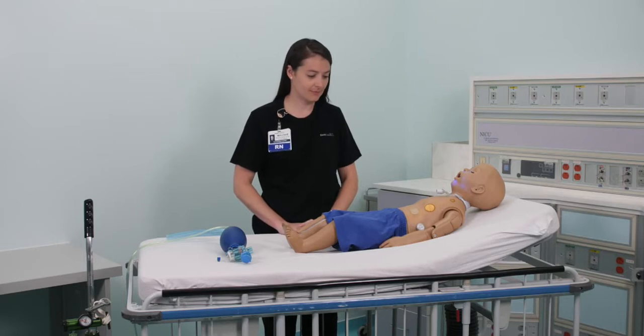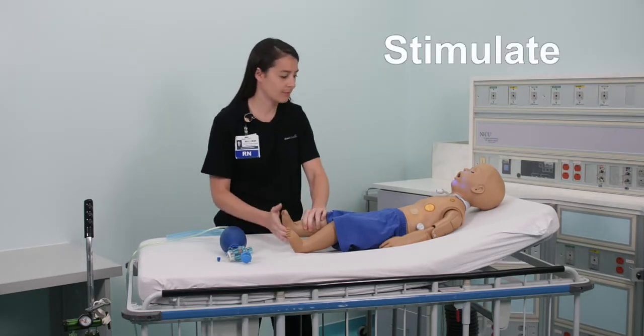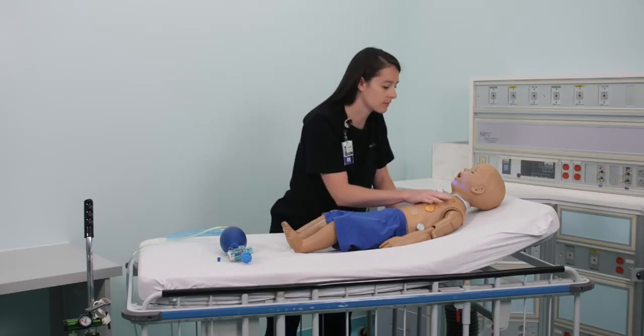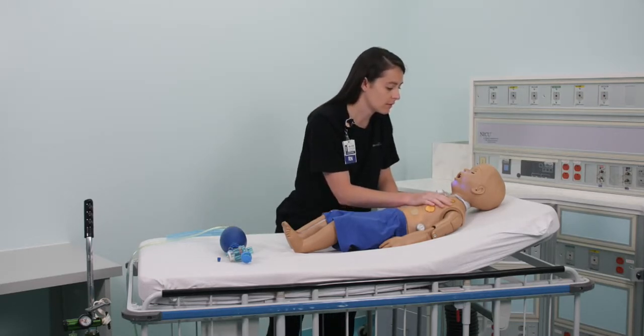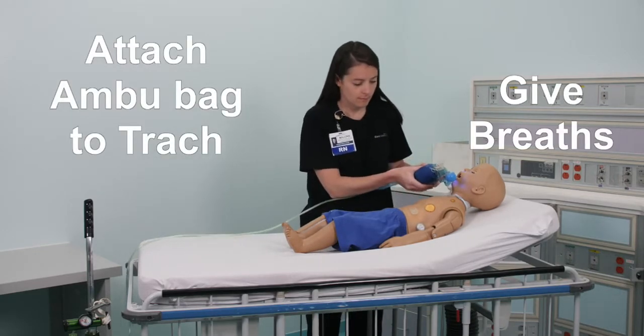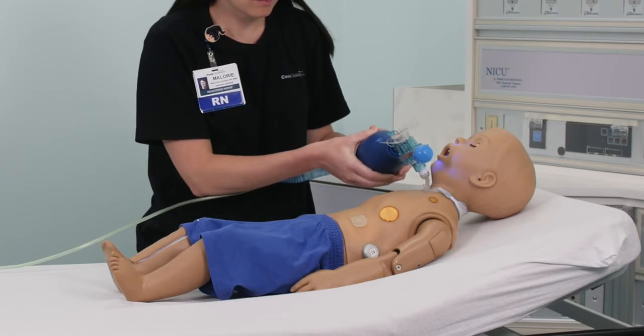Now let's put it all together. Stimulate the child. Look, listen, and feel for breathing. If the child is not breathing, blue in color, or not responsive, attach the ambu bag to the trach and give breaths. Remember to squeeze the bag with enough pressure to make the chest rise.